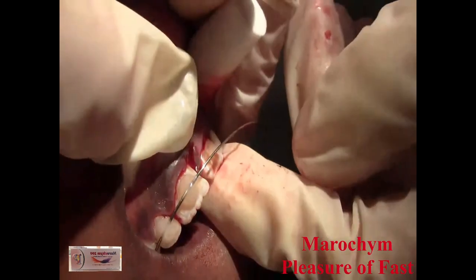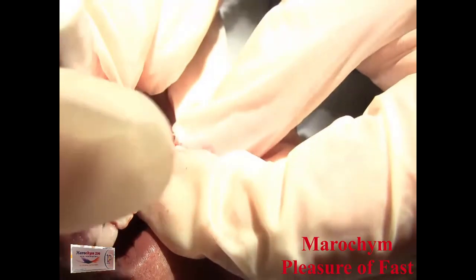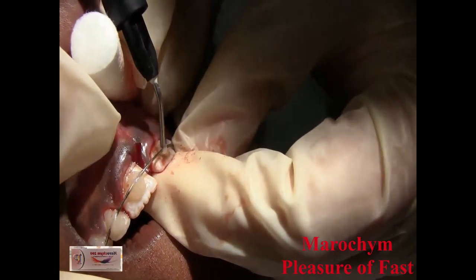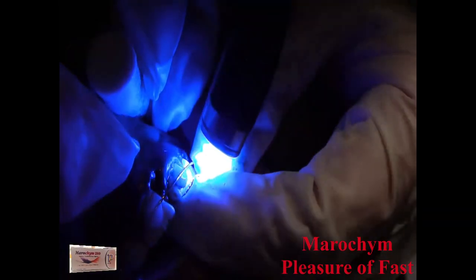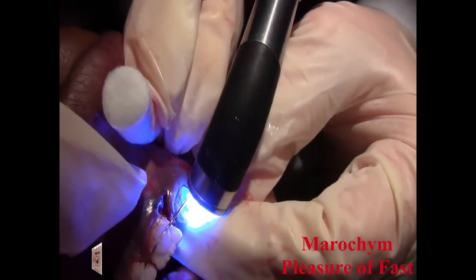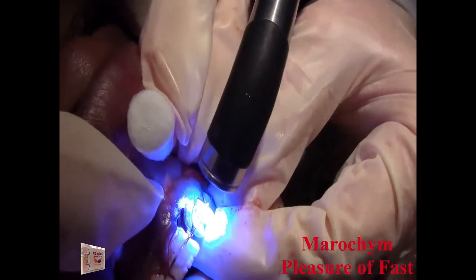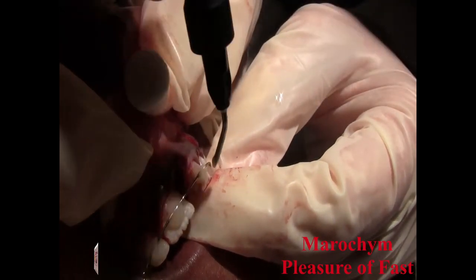Okay, sweetheart. What I'm going to do is hold this tooth. I'm just trying to clean it off a little. Can't see if my finger's in the right spot. Oh, I'm sorry, honey. I know. I'm having to pull the tooth forward. I'm pulling her lip over her head. She probably doesn't like that. Actually, going to add a little. Oh, you're doing great. We're almost done.